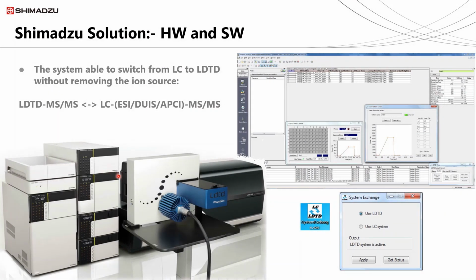I said in previous slide that LDTD does not require mobile phase. However, you can see that HPLC is still connected to the instrument. This is because the same system can easily be used with LDTD and without LDTD as a conventional LCMS system by just clicking in the software, and almost there is no need to change in hardware.